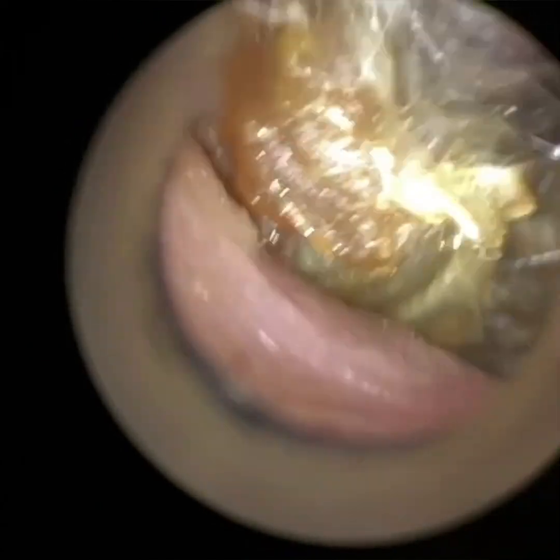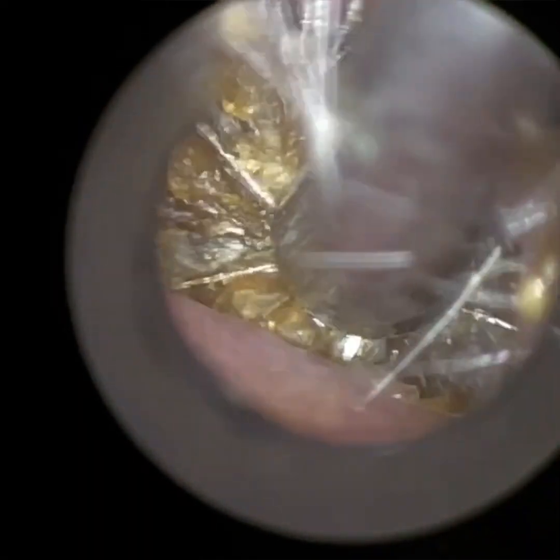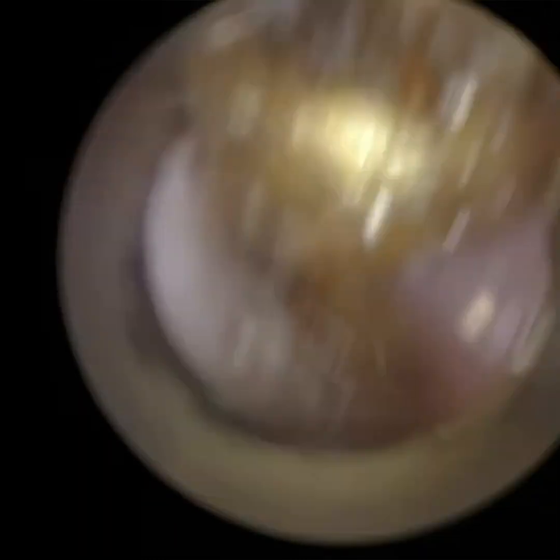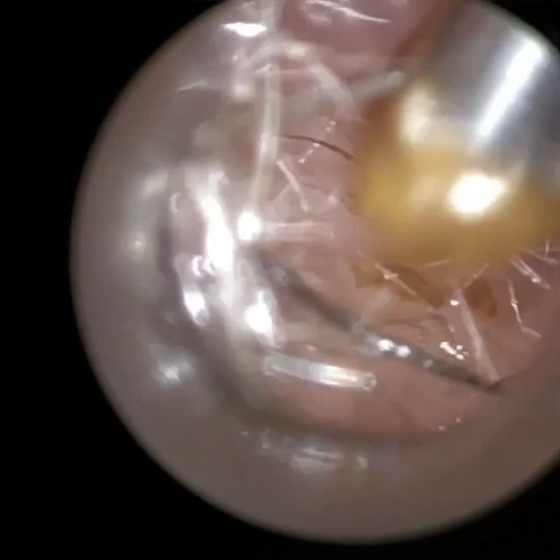Headworn microscopes and loops are a lot cheaper and portable. However, the magnification with both is limited, especially in comparison to the Waxcope and ENT microscope. I've previously used headworn loops, and I would really struggle to remove wax deep in the ear with them. Even with better-quality ones I've since tried, I would struggle to perform delicate procedures on the eardrum. If the wax is on the outer half of the ear canal, they're more than adequate, but for anything deep and intricate, I'd lack the confidence.